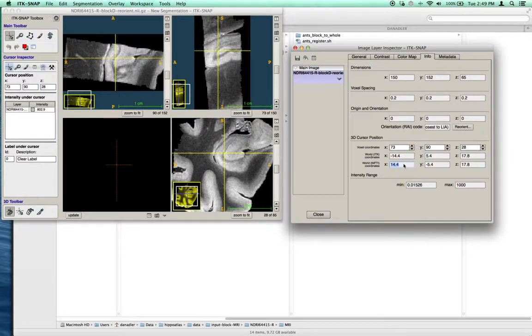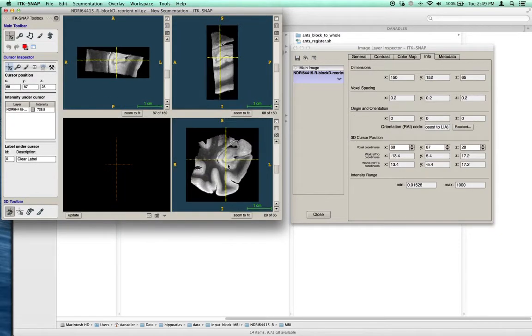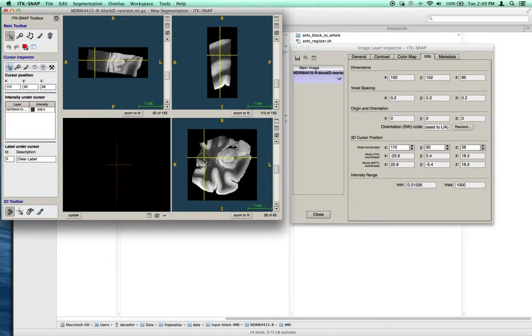Now HistoloZee also has world coordinates, which correspond to this third row here, NIfTI world coordinates, not the ITK world coordinates. They're very similar, except for a negation applied to the first and second parameters. Very important to know this, though. So within HistoloZee, we can make sure that everything is aligned to world coordinates and thus have mappings between our MRI images and our histology slide images.